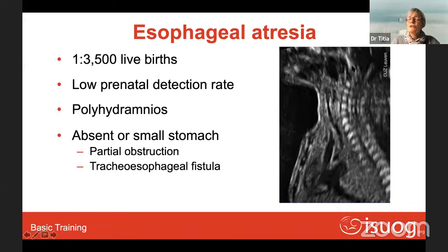So be aware that you cannot see the esophagus because the esophagus is collapsed. There's nothing in it. It is collapsed unless fluid goes through it. And therefore, you will not be able to identify esophageal atresia by looking at the esophagus. It's the indirect signals.